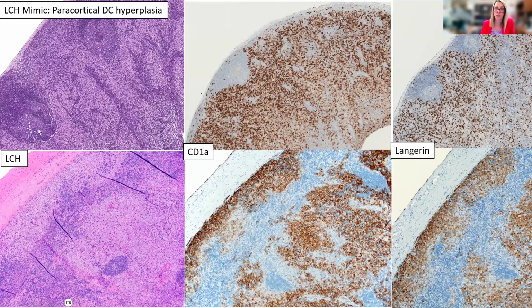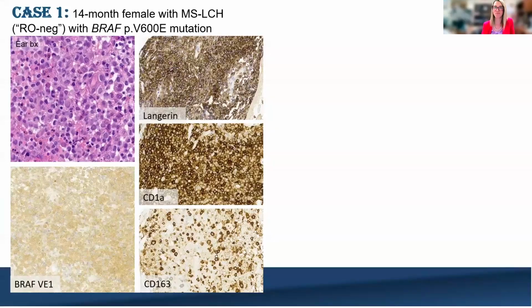can see the nice retained follicles, and you can even demonstrate, even sometimes on a CD20 stain, those B cells still compressed up against the capsule. You'll always see one or two CD1a and langerin positive cells in the sinus because they're translocating through, but it's knowing that sort of pattern and distinction that will save you from getting into trouble.